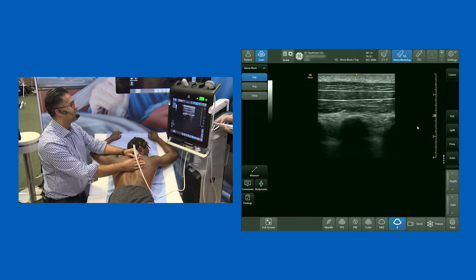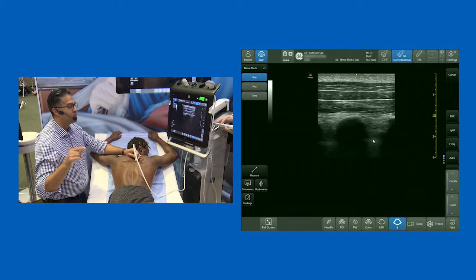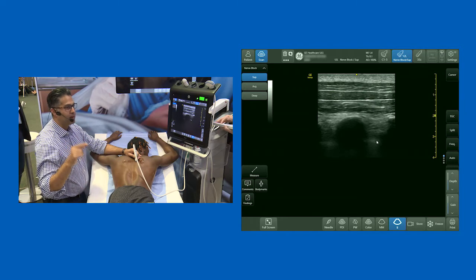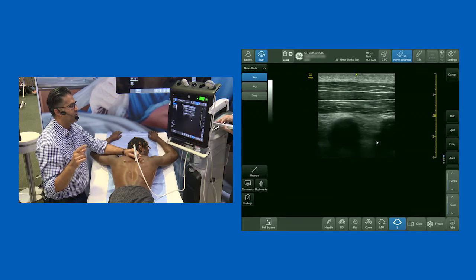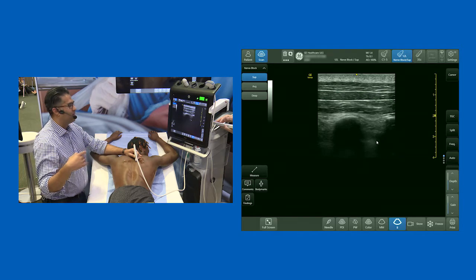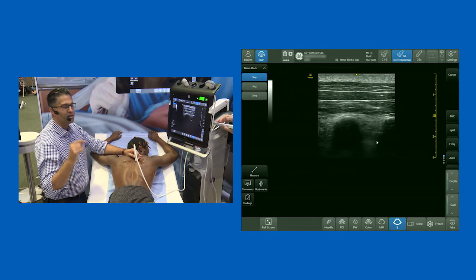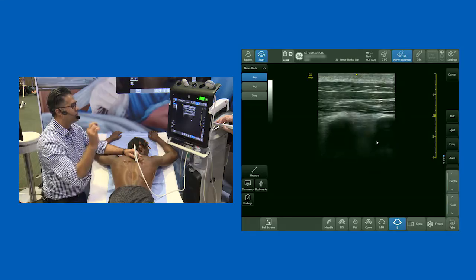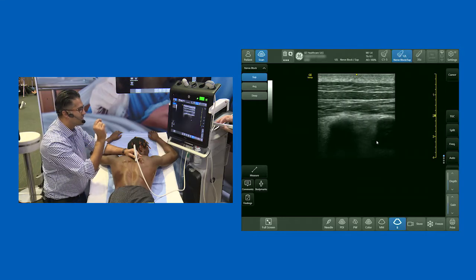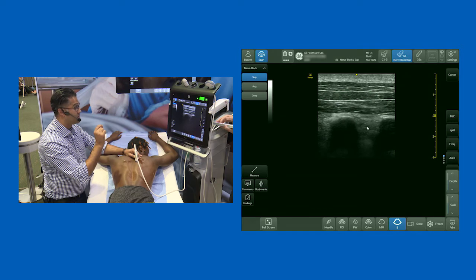You can see over here we've got a transverse process and we've got pleura deep to it. In this view — and I haven't optimized it for paravertebral scanning — it's not that clear where your needle endpoint should be. The pleura is there, and you wonder if you'll see your needle if you get down there. With the MTP block, you bring your needle in-plane or out-of-plane and just aim to pop it in that mid space between the transverse process and the pleura — it's about there.